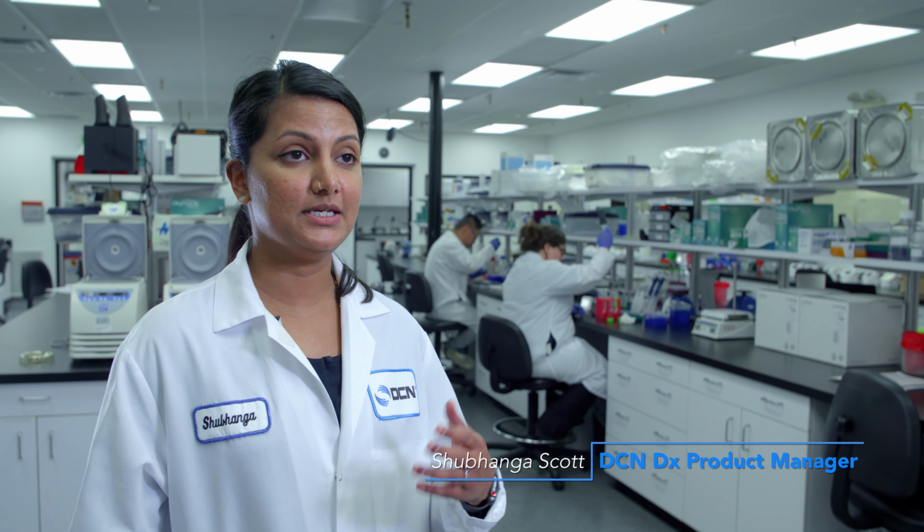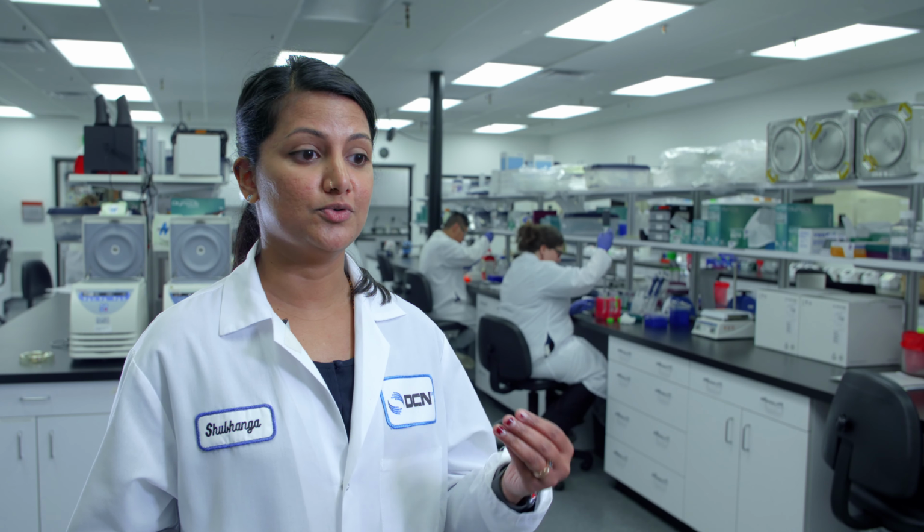Lateral flow as a technology is a very straightforward, very effective technology for rapid tests. Rapid diagnostics are kind of what it sounds like. You're getting your diagnostic answer between 2 to 15 minutes. Unlike the traditional testing methods where there's long incubations, it'll be hours before you get a lab result. Rapid diagnostics means you have your sample and within, waiting at the doctor's office, you have an answer.